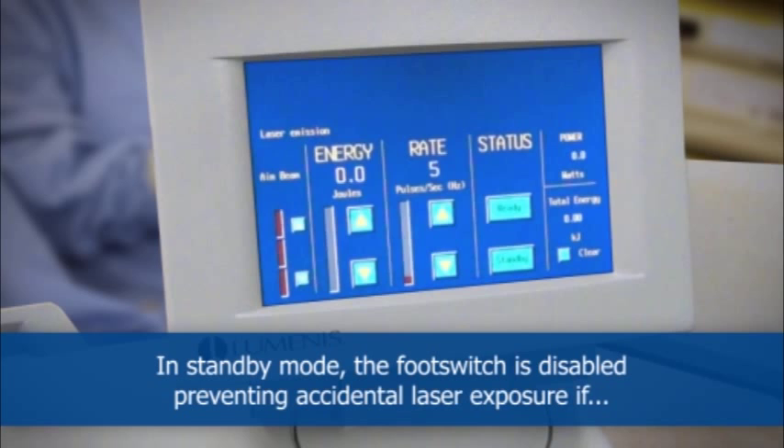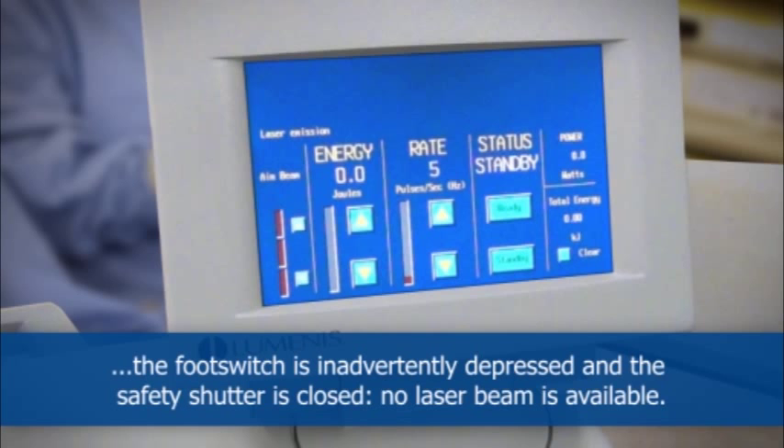In standby mode, the foot switch is disabled, preventing accidental laser exposure if the foot switch is inadvertently depressed, and the safety shutter is closed so no laser beam is available.